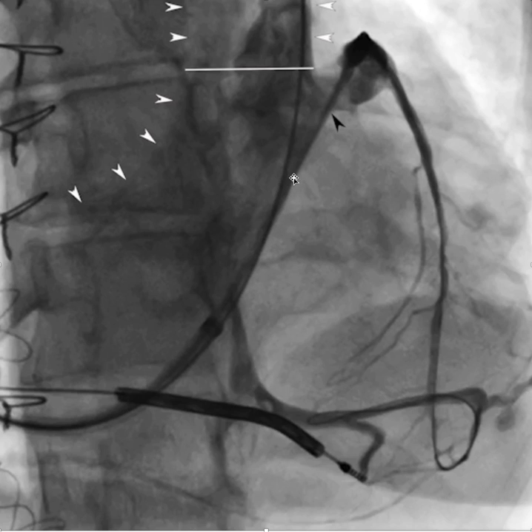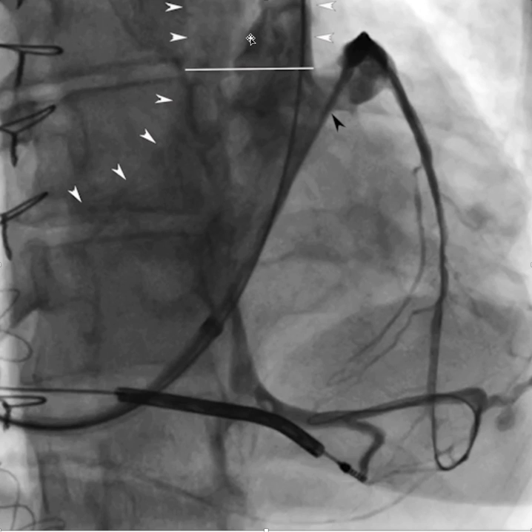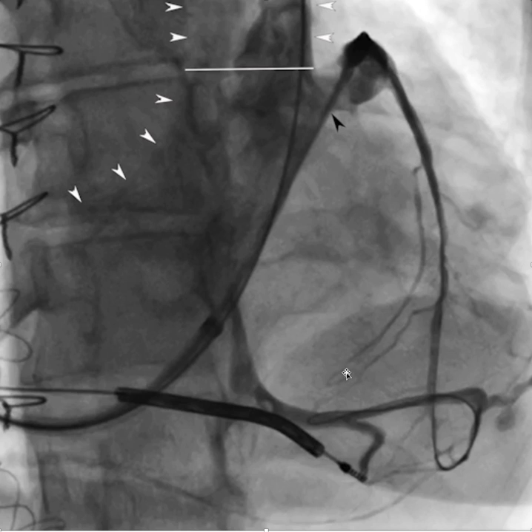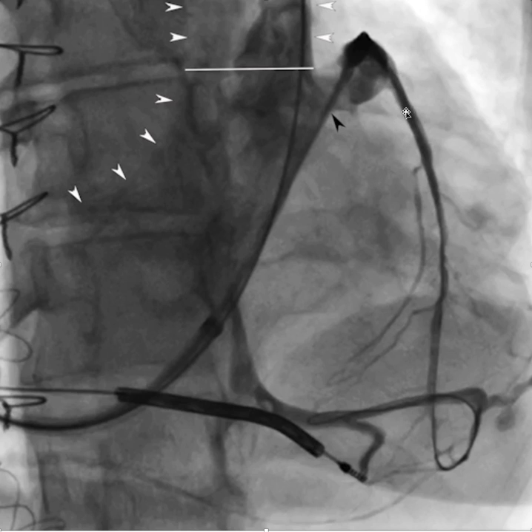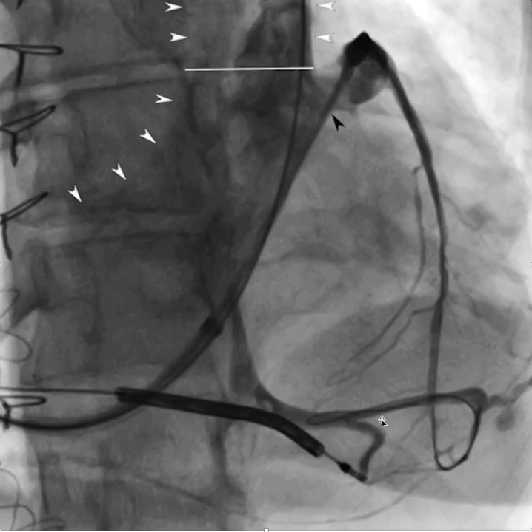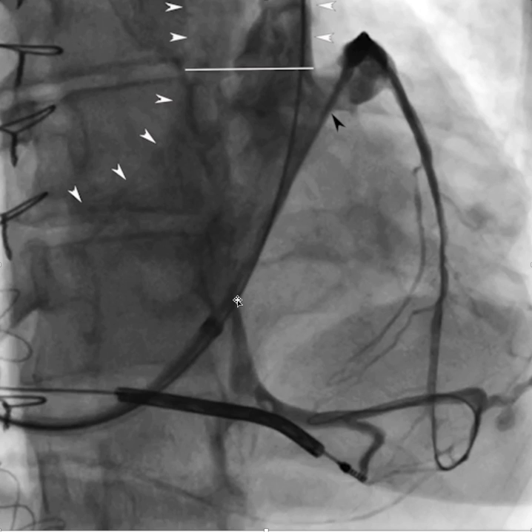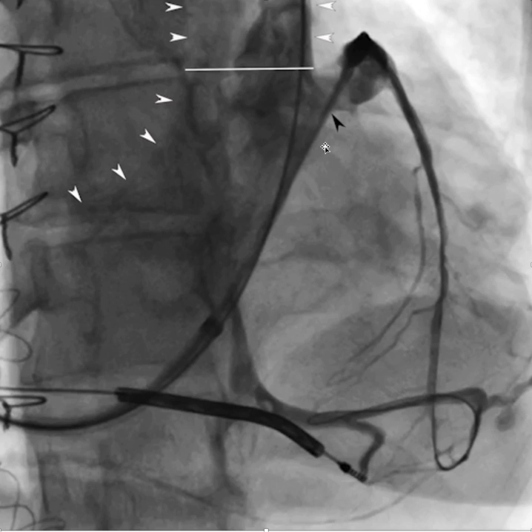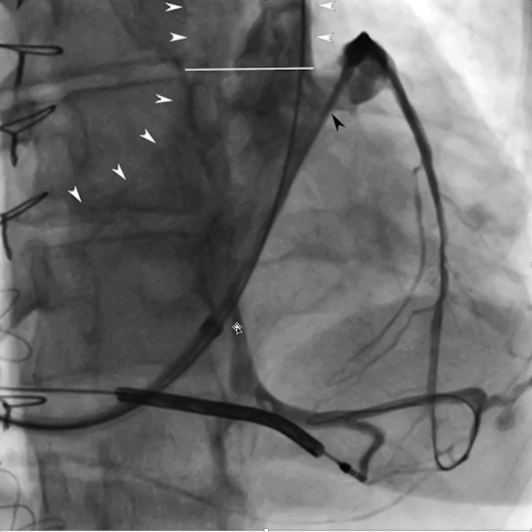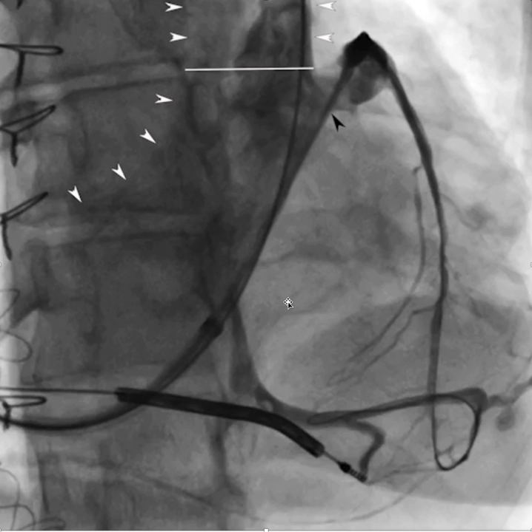We've been able to direct our catheter laterally and avoid going up into the left subclavian, thus identifying the great cardiac vein. We injected the great cardiac vein with contrast and now see with retrograde filling down the anterior ventricular vein collaterals to a lateral wall target branch, which then empties into the coronary sinus. By vigorously and selectively injecting the great cardiac vein and anterior ventricular vein with contrast, we're able to identify the lateral wall target vein rather than using a balloon.